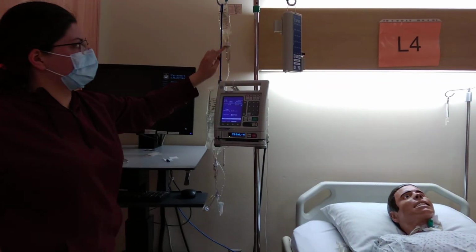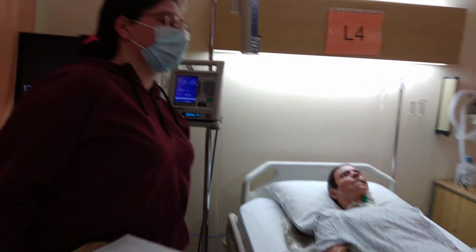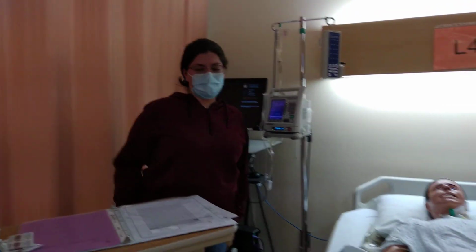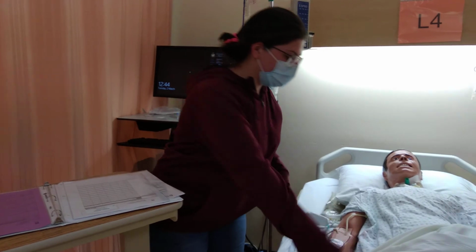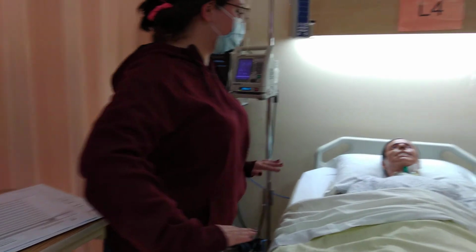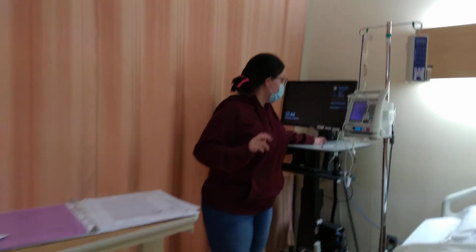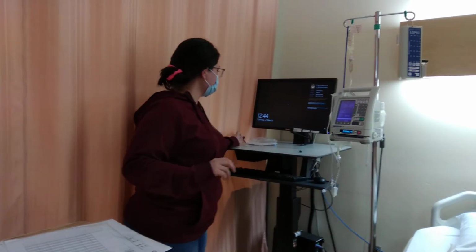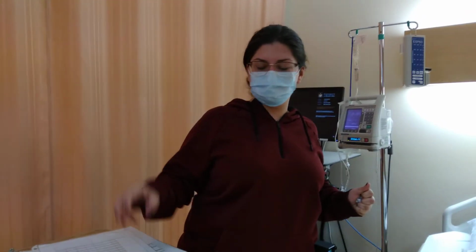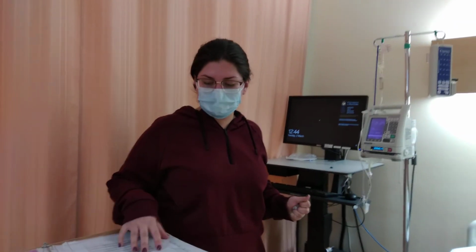And I'm going to be watching for the drops in here to make sure that my medication is infusing. I'm going to let my patient know that I'll be back in 15 minutes to make sure that the primary is going to start up again. And I'll give them a call bell. I'll make sure that they're comfortable and reassured, and going to perform a safety exit check. So nothing on the floor, they're not in any distress. Yeah, and I'm going to document on my MAR with my initials and my designation that I'm a student. Sign it, write the time.